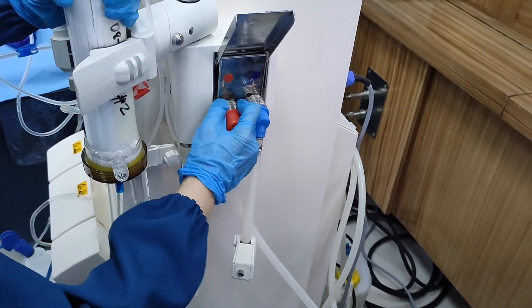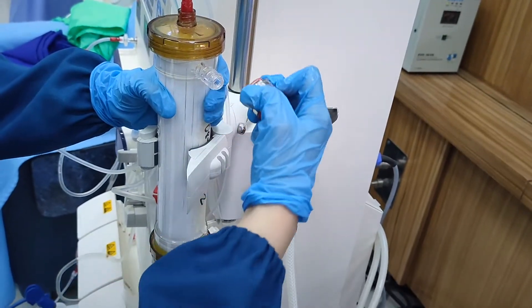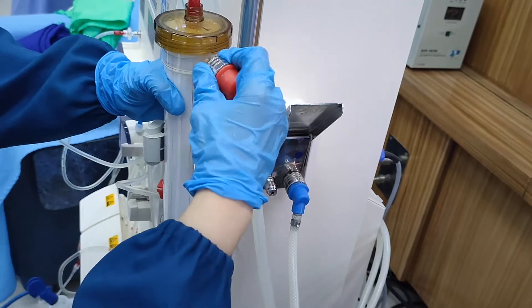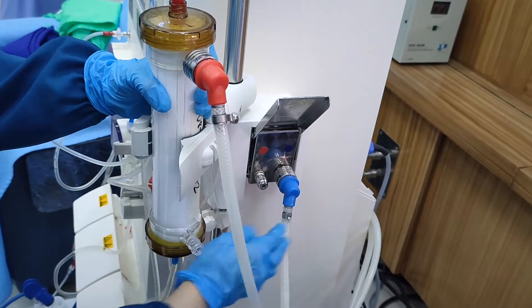Open the shunt cover and attach the couplings. The red couplings must be placed on top and the blue couplings at the bottom. Secure them well and close the shunt cover.